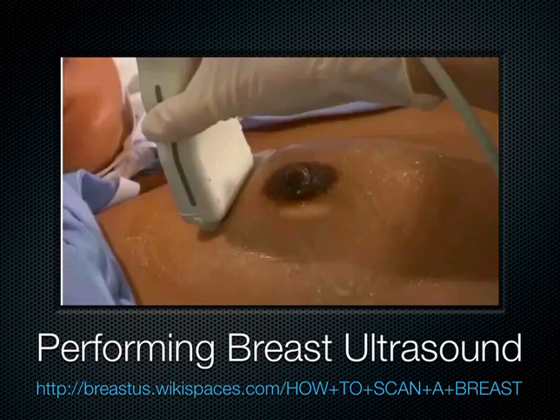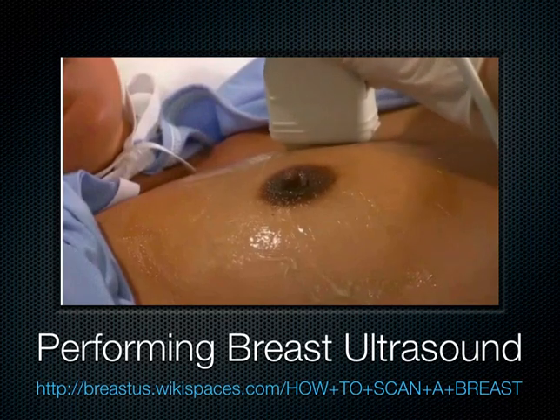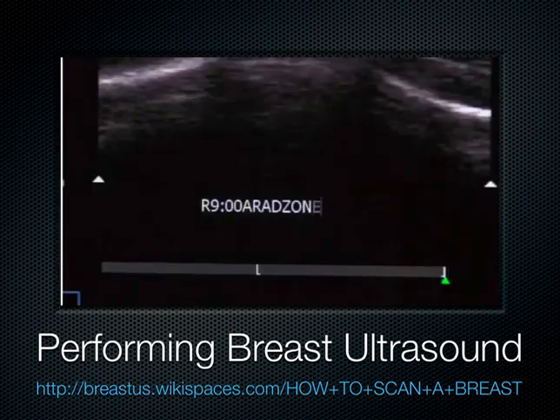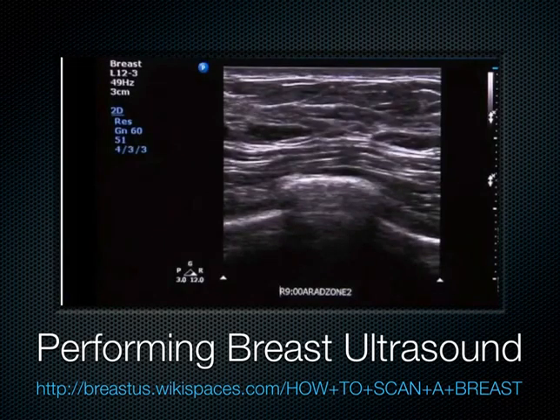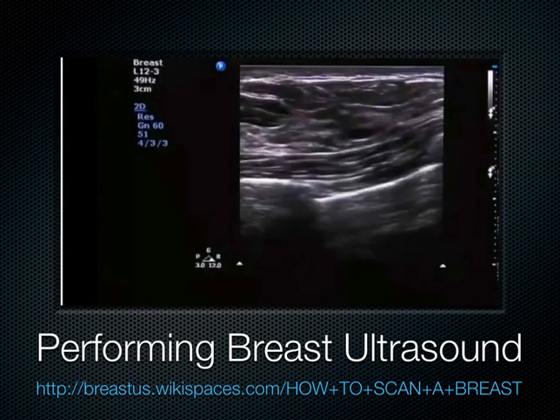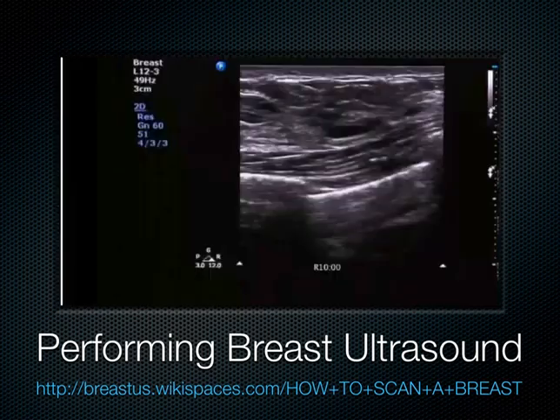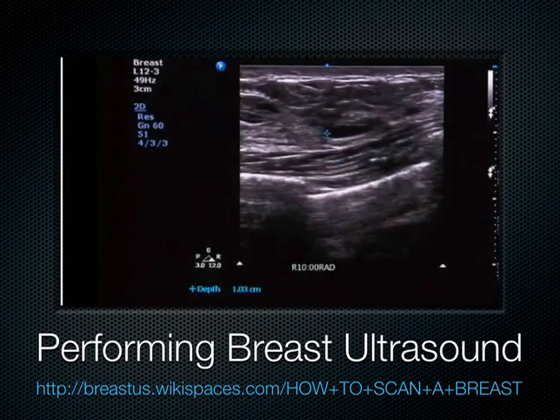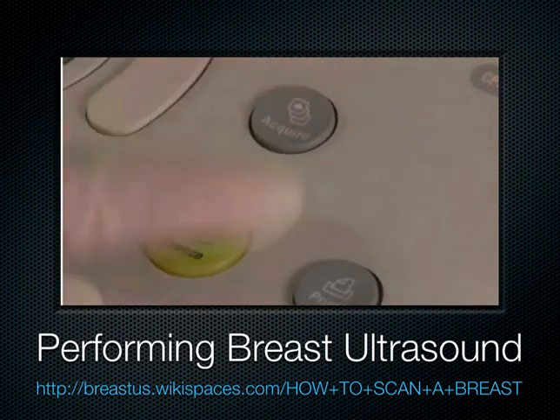At the clock face positions 12, 3, 6, and 9, freeze, annotate, and save a suitable image from the mid portion of the breast. If a lesion is encountered, manipulate the transducer and optimize the image. Freeze and annotate according to the protocol. Measure the length of the lesion by placing 2 calipers on the superior and inferior margins of the mass. Measure the height of the lesion by placing 2 calipers on the anterior and posterior margins of the mass. Save the image and unfreeze to continue.